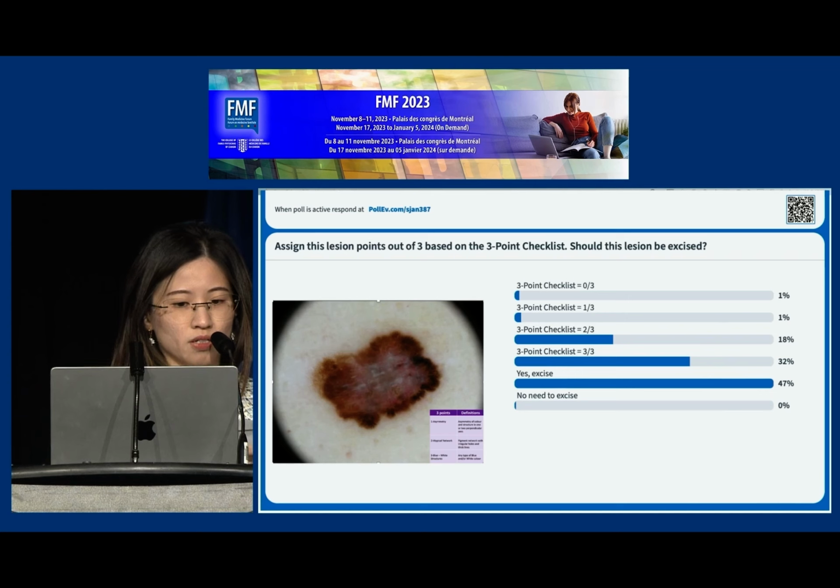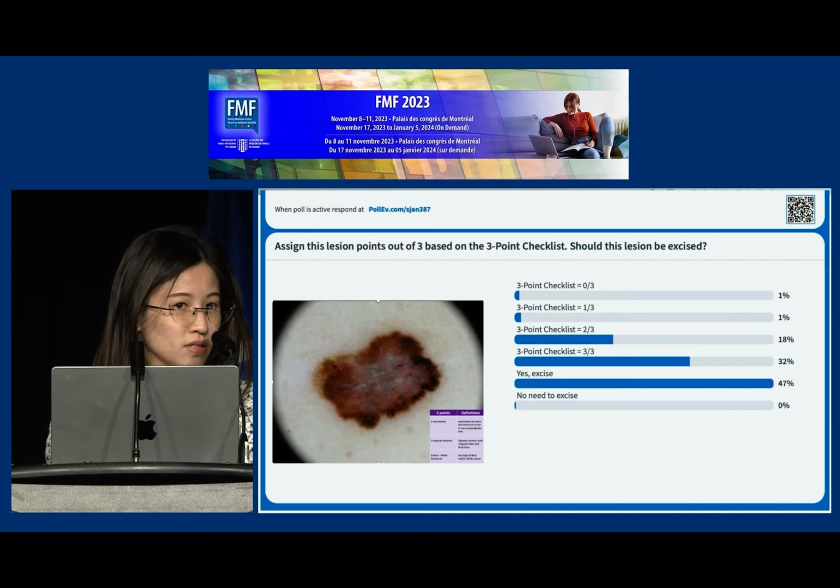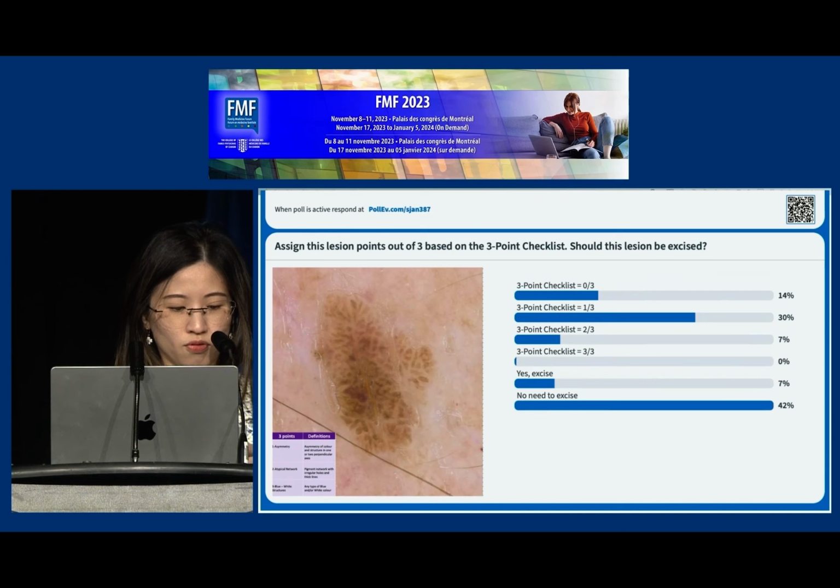That checks all our points. I just want to point out, if you look on the side of the lesion, there's all this what we call radial streaming. It's like things coming out like a needle. That's actually a sign of bad stuff. So Spitz nevi, melanoma in situ, it signifies growth. Whenever you see those things, especially if it's not symmetrical, definitely something to watch out for.